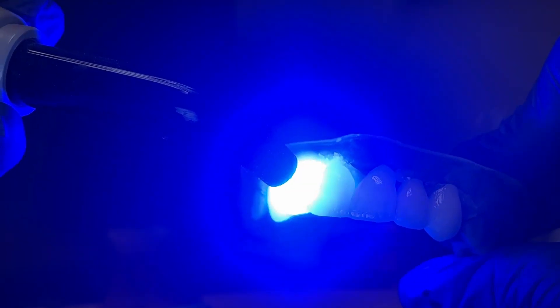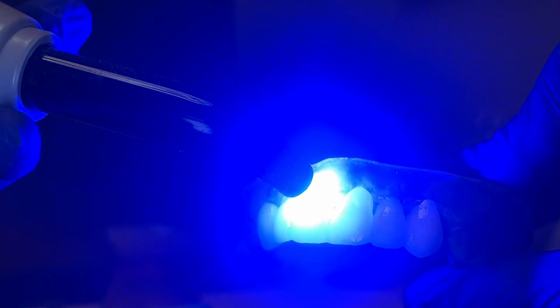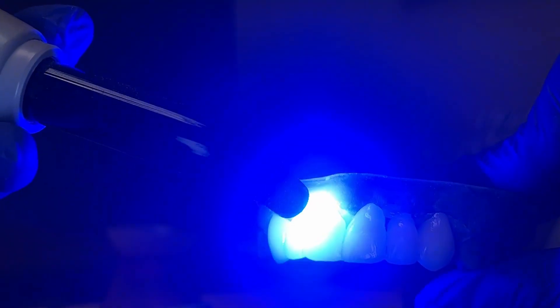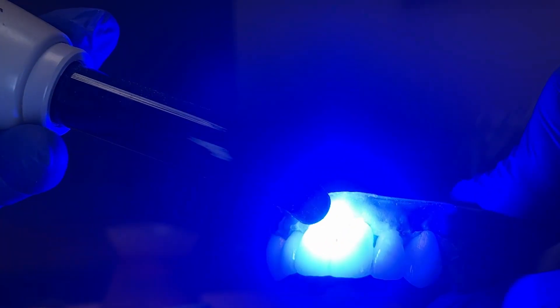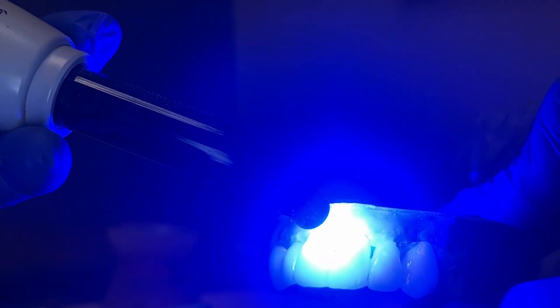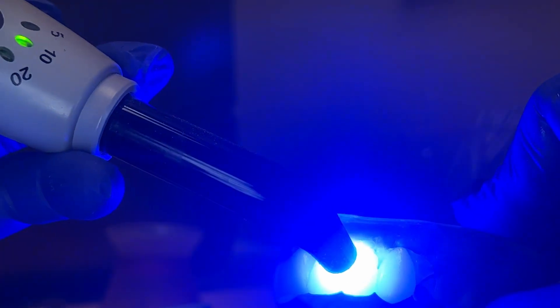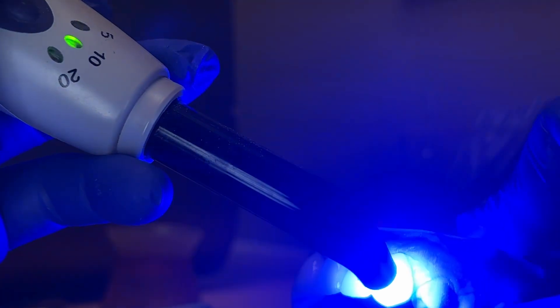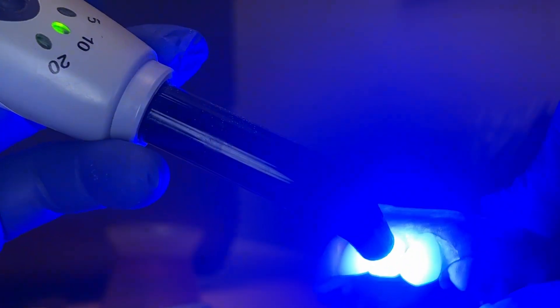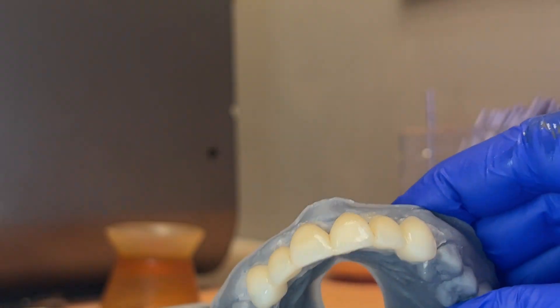Make sure you test your curing light and make sure it goes to the right wavelength — it has to get to 400 to 500 nanometers. Make sure your lights are good because when they get older they can die out and you don't know it. You can start getting patients with sensitivity after fillings, and your materials might not be fully set — that's dangerous if we're not using our materials the way we're supposed to.